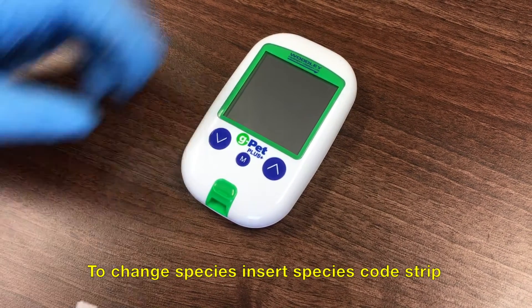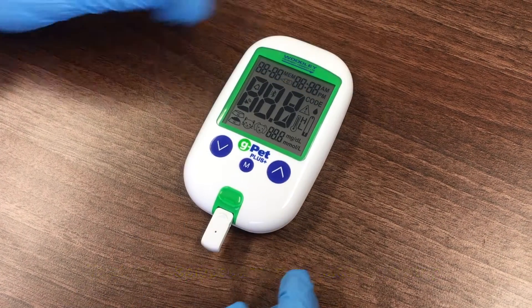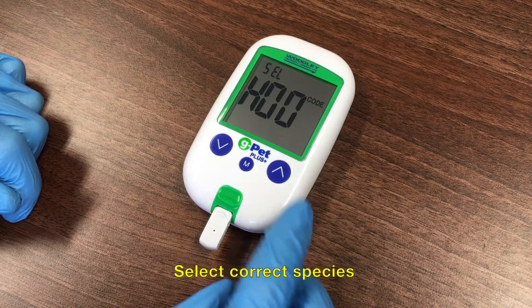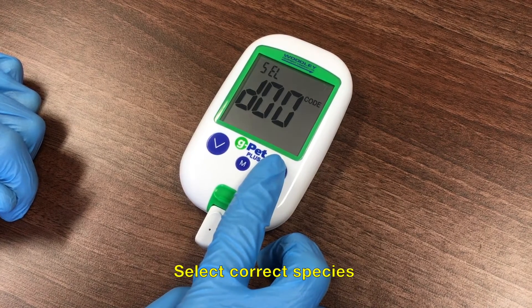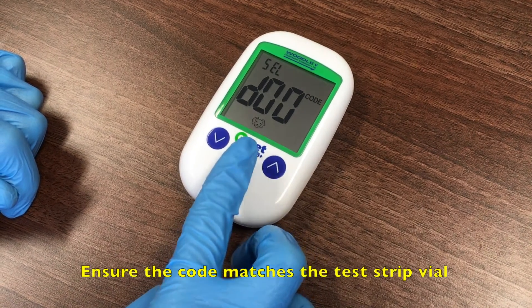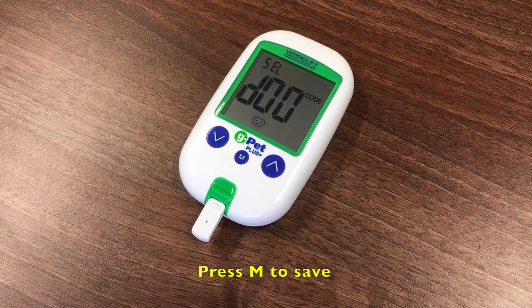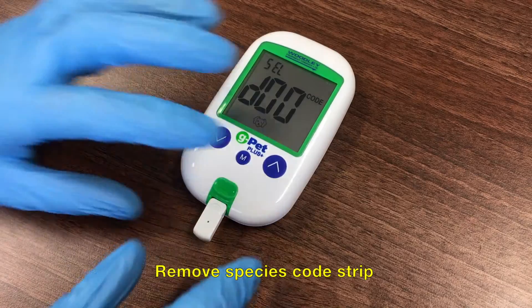To test a sample, insert the species code strip into the test port. When the GPET Plus turns on, use the arrow keys to select the correct species: cat, dog or horse. Ensure the species code matches the code on the test strip vial and press the M button to save. Remove the species code strip.